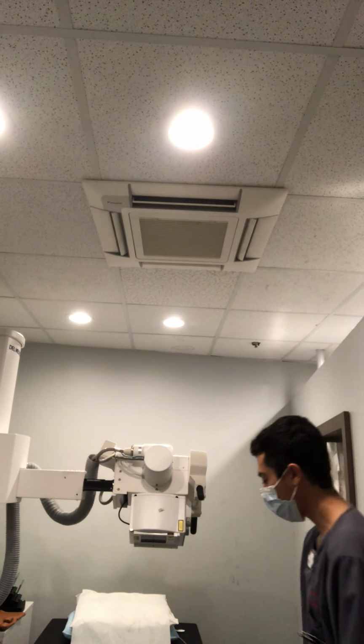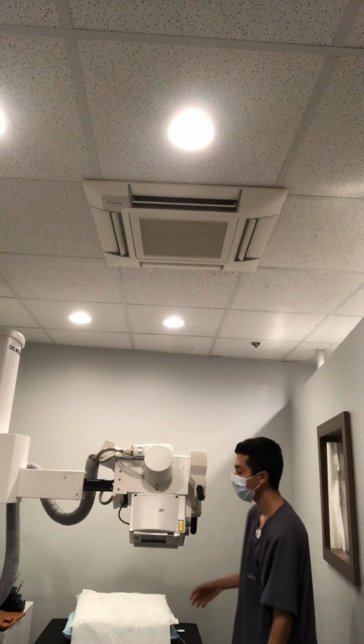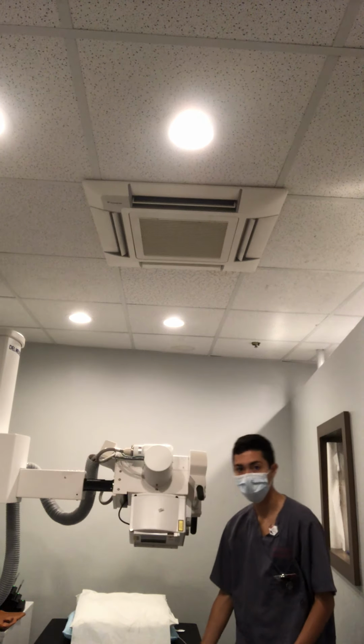Hi, my name is Juan Filipino, and I'll be talking about my TMJ closed mouth projection for the project. Okay, so I'll just demonstrate on myself how we would do it. But I have my checklist right here so we can go over it.